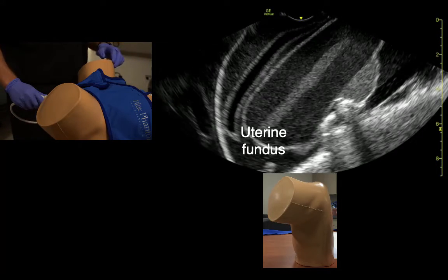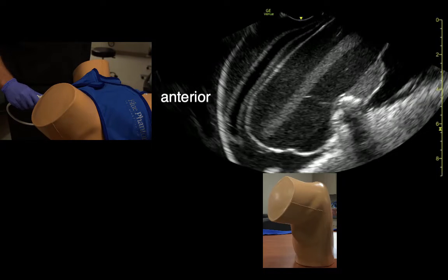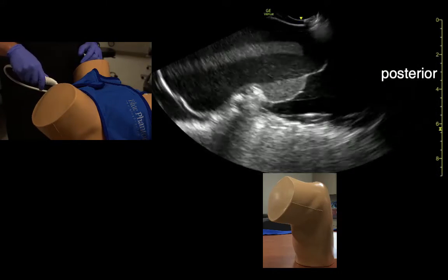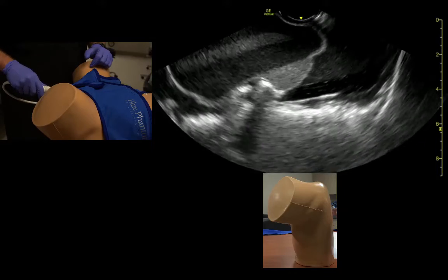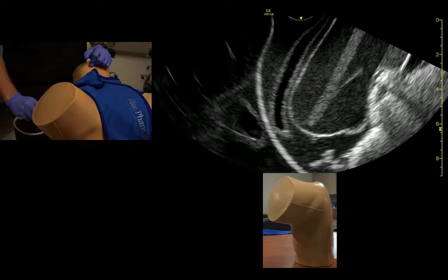We remember that the abdomen is to the left of the screen and the patient's back is to the right of the screen. The floor is back here — the posterior cul-de-sac — and we rock the probe towards the ceiling to see the bladder and anterior structures.